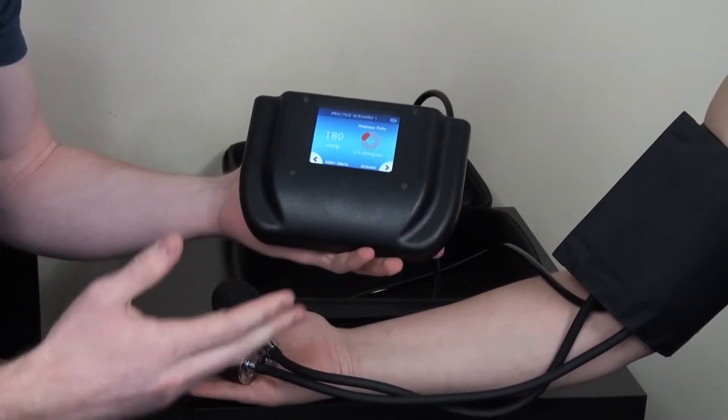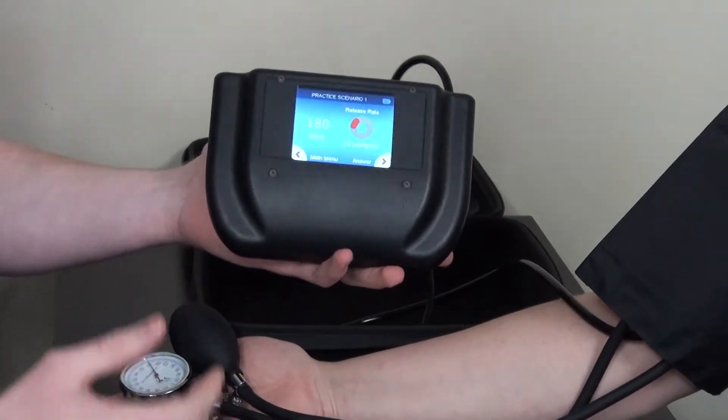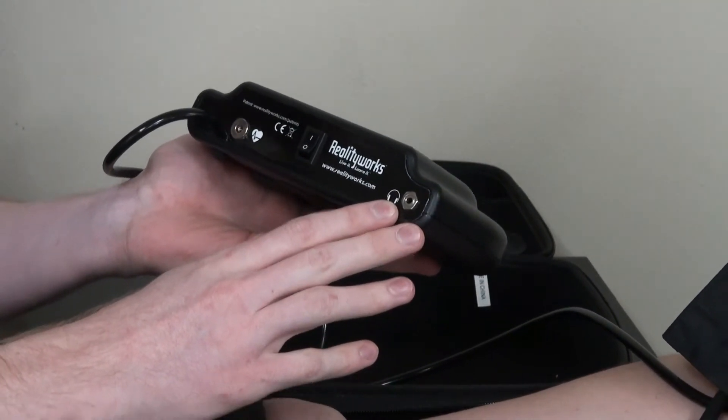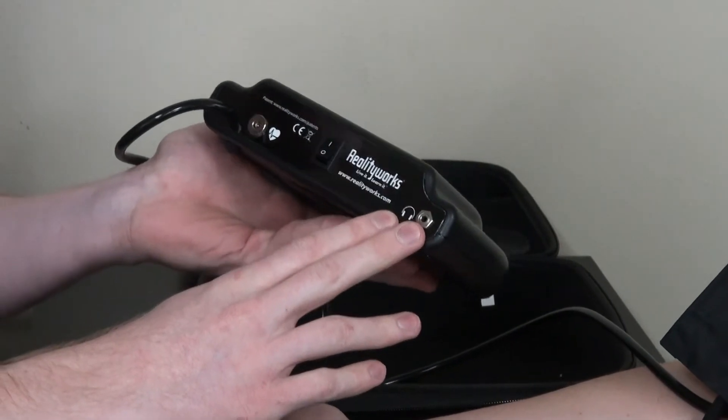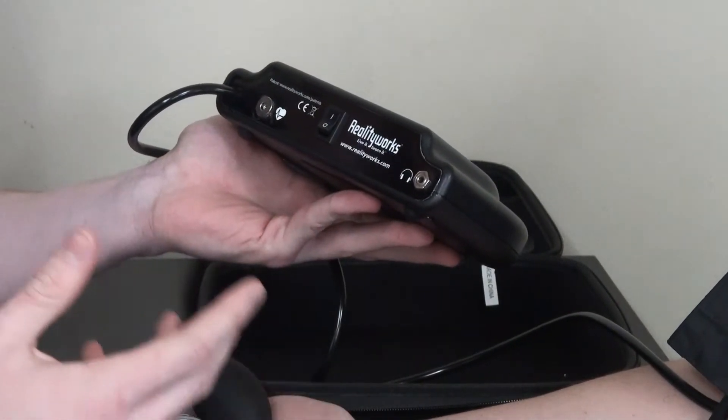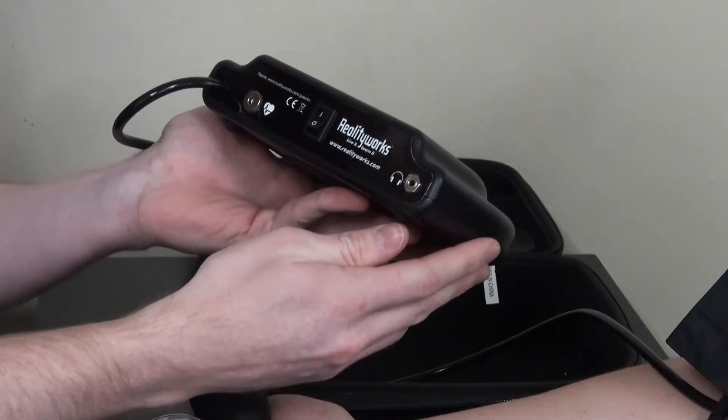While the student is performing these tests, the teacher can plug in a set of headphones into the back or the audio system for the classroom and play the Korotkoff sounds that that student is hearing during the simulation.